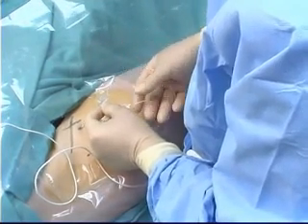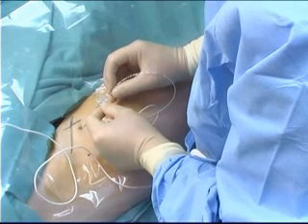The motor response will immediately start again, and the broad black mark on the catheter indicates that the catheter tip is situated at the tip of the needle, but it is not yet protruding from the needle tip. The needle should never be manipulated if this broad black mark is not completely visible.